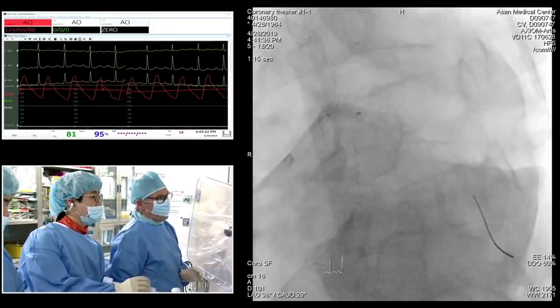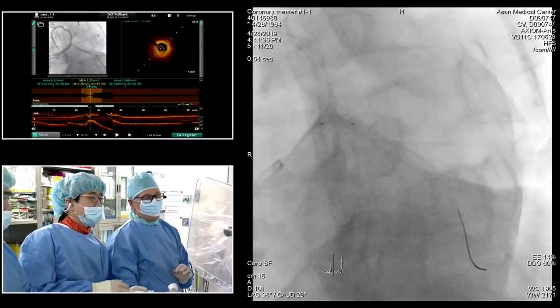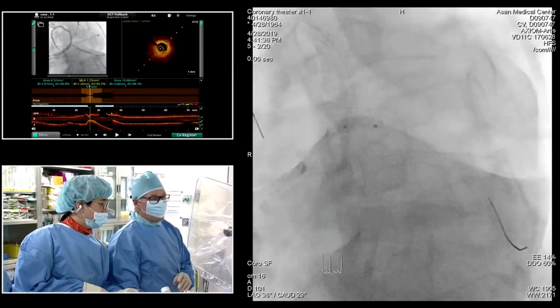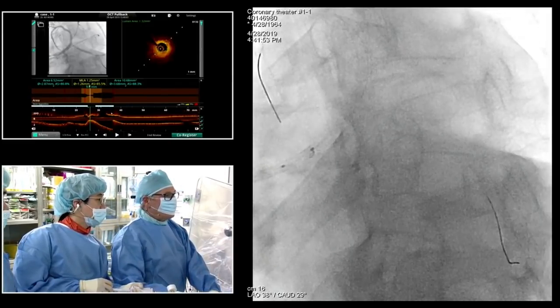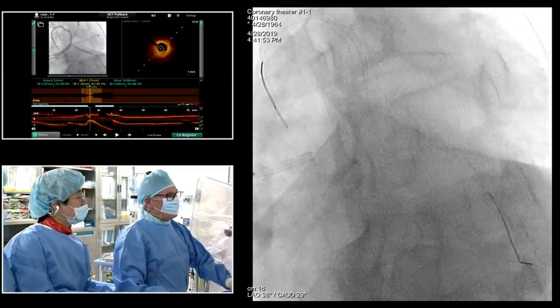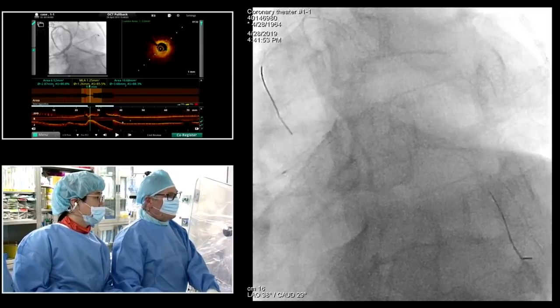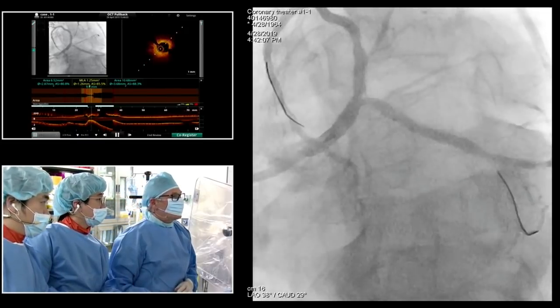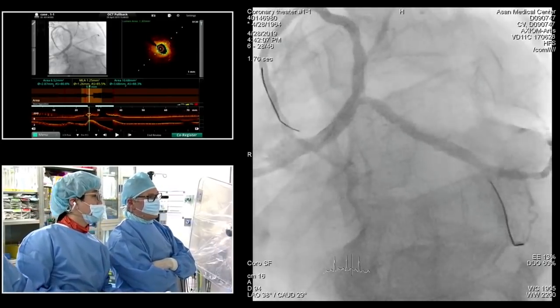So do not deflate too early. Our plan is to do a pre-dilatation with a high-pressure non-compliant balloon, check the result, and if we have a good result, because I don't like to have 2 layers of stents, we'll do a drug-eluting balloon. But if not, we have to think about another approach. Will you choose the cutting balloon or Scoreflex for the lesion preparation first?